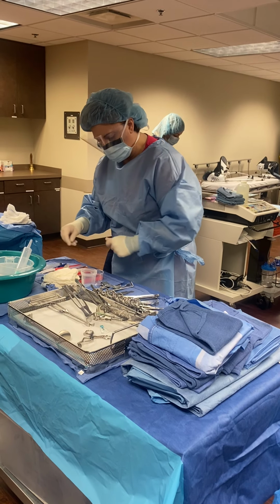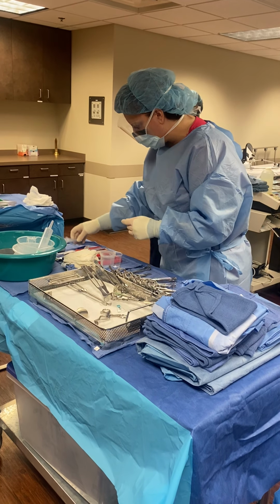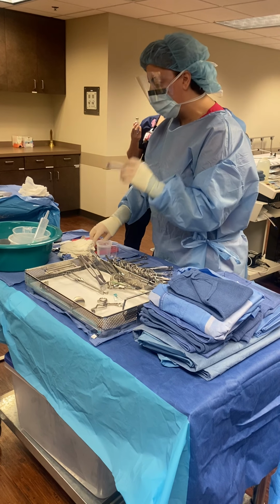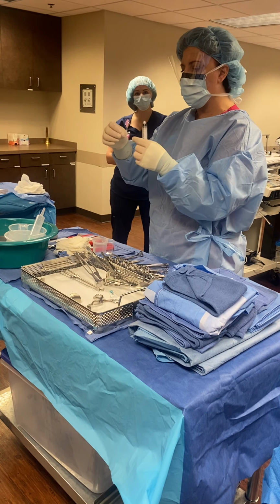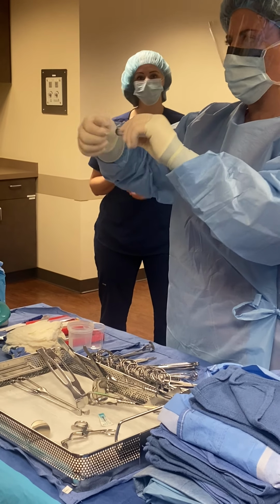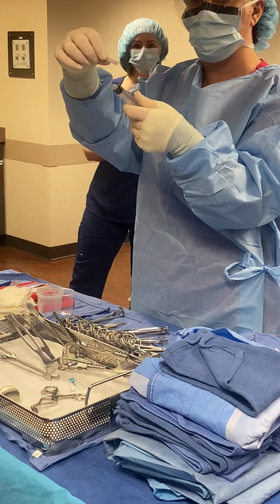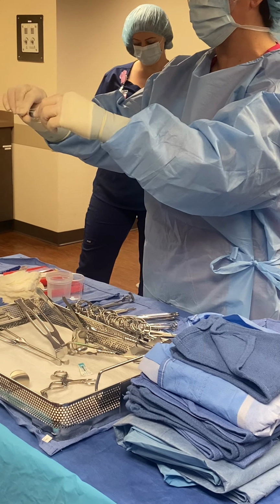Medicine. Ooh, medicine. Okay, so for this trick, we're going to be drawing up our medication. We want to label our syringe first, and we want to put the 18 gauge needle on. It's the biggest needle. It's a Luer lock, so that means it twists on. There's a slip tip too where it just pushes on, but this has little locking mechanisms, so you just put them together and then twist in opposite directions, just snug.